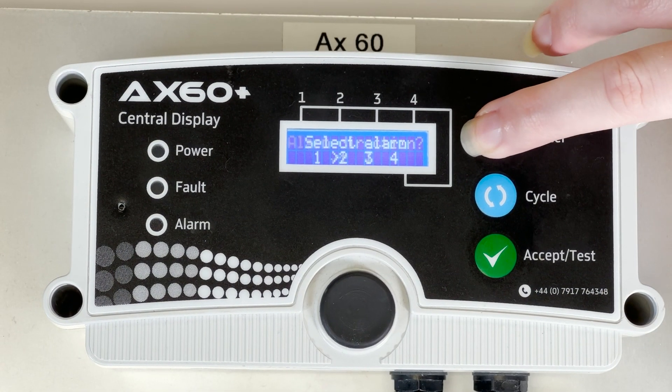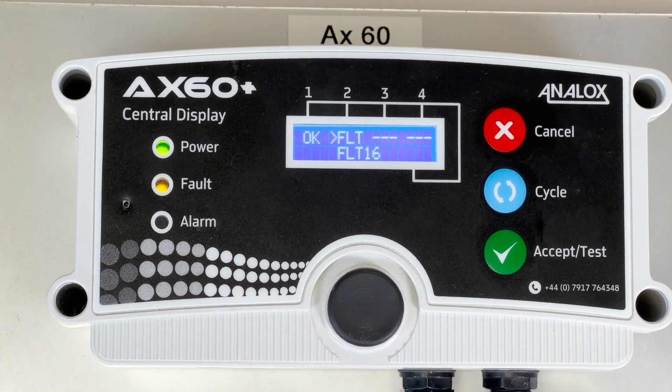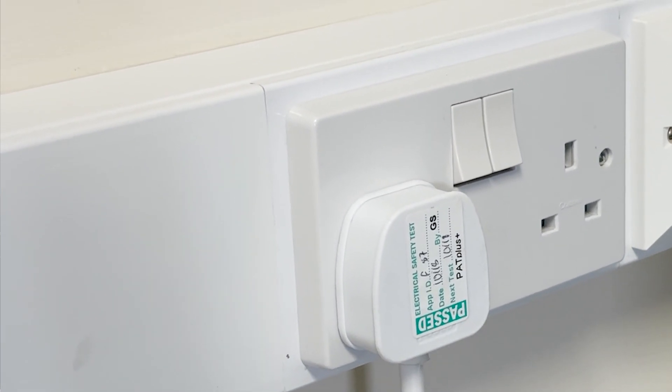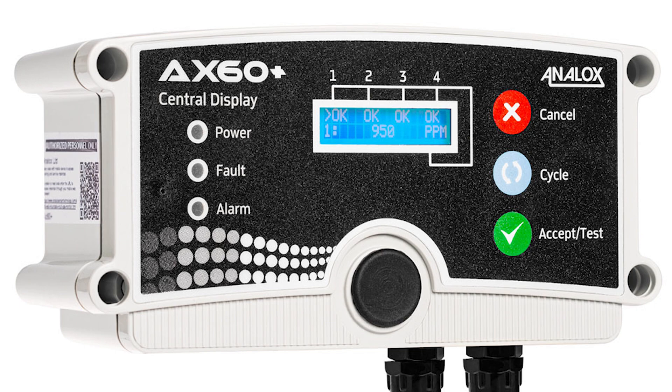Press the cancel button five times to return to the screen where the sensors are displayed. Acknowledge any faults with the accept button and now you can power cycle the device one more time. As you can now see the device is now working properly again.